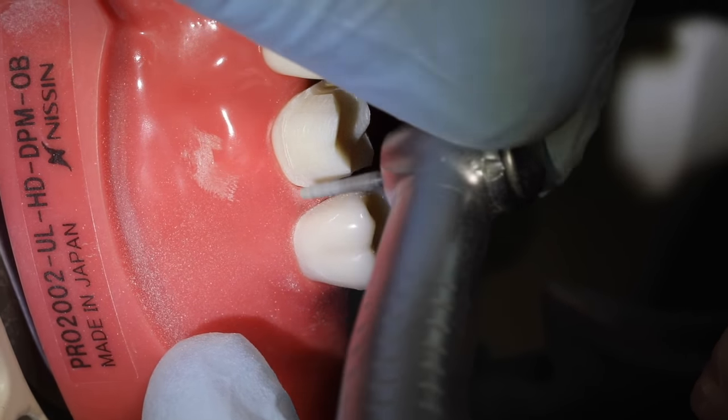Now we'll add our second facial plane in out here. Typically, the facial plane is divided into a gingival third and an incisal or occlusal two-thirds. So we'll want the change of direction to occur at the junction of the gingival and the middle third. So we'll come back in with this. On some teeth, it's a very subtle change. We're keying off that second molar; really a lot of what we're doing is lining this burr up back there.